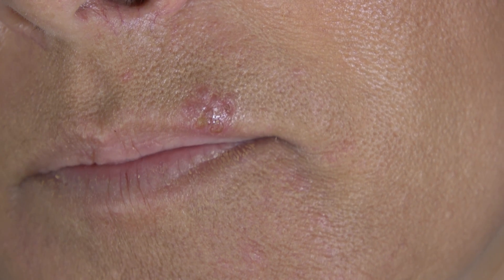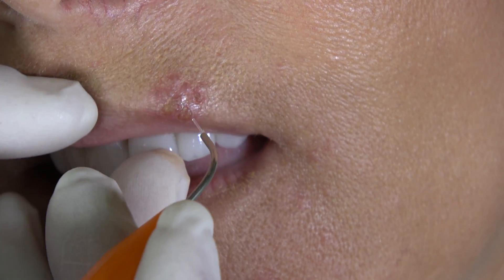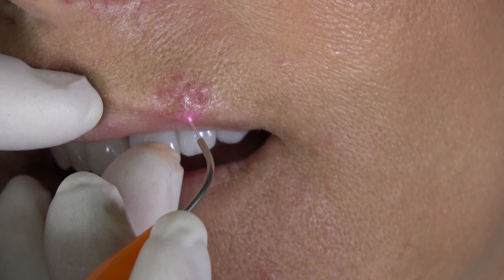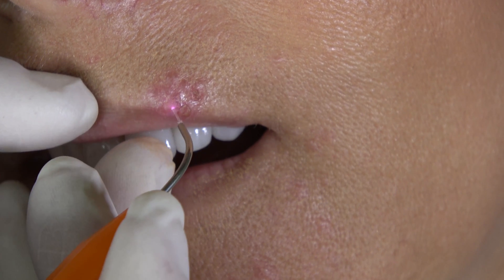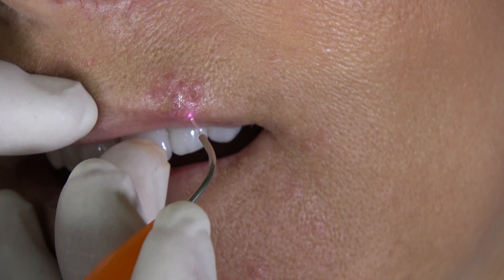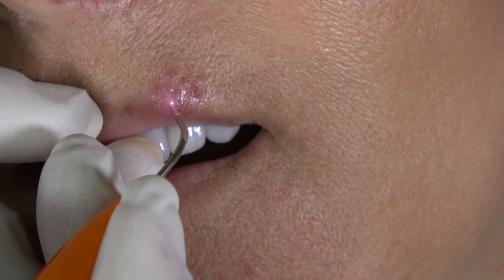Let's bump it up another tenth of a watt, so we're at 0.8 watts. We started at 0.5 — I think I may have said we bump it up a watt per interval, but it's a tenth of a watt. So we started at 0.5 and now we're at 0.8.